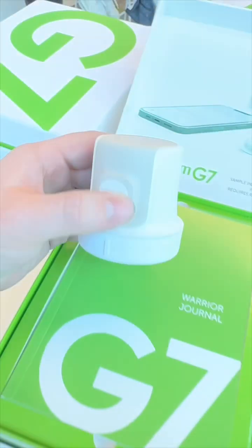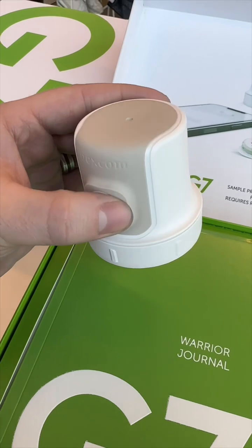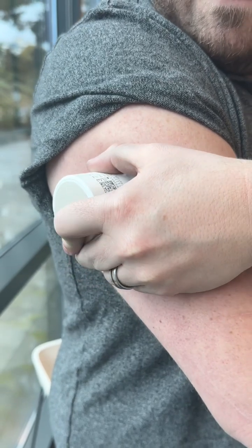The new G7 is 60% smaller than the previous generation and is contained in this really easy-to-use insertion device. This is now an all-in-one device, so the sensor and transmitter are both included inside of the single application process.